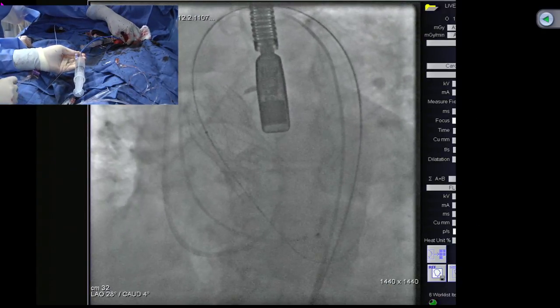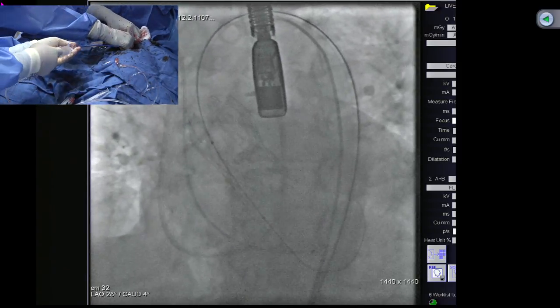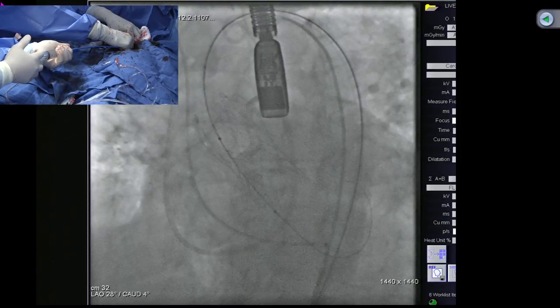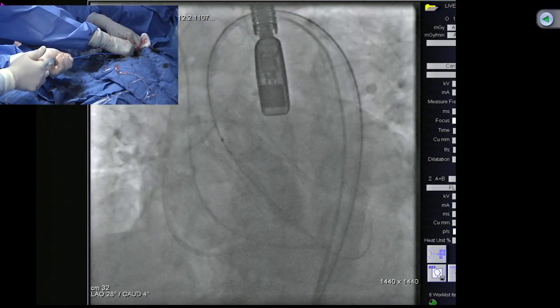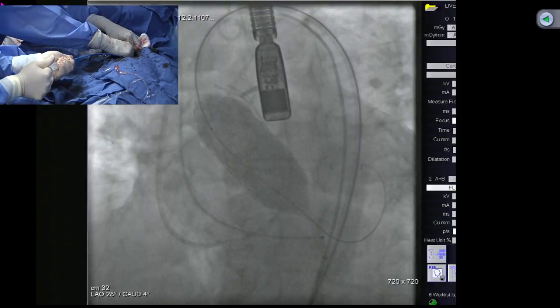Okay, next step, we're starting with the pacing. Where's the pacer? Yeah, start pacing at 180. Now we have to make sure the blood pressure is about 50. About 160. Okay, good. That's good. Start to go. Good. It expanded. You see it expanded.